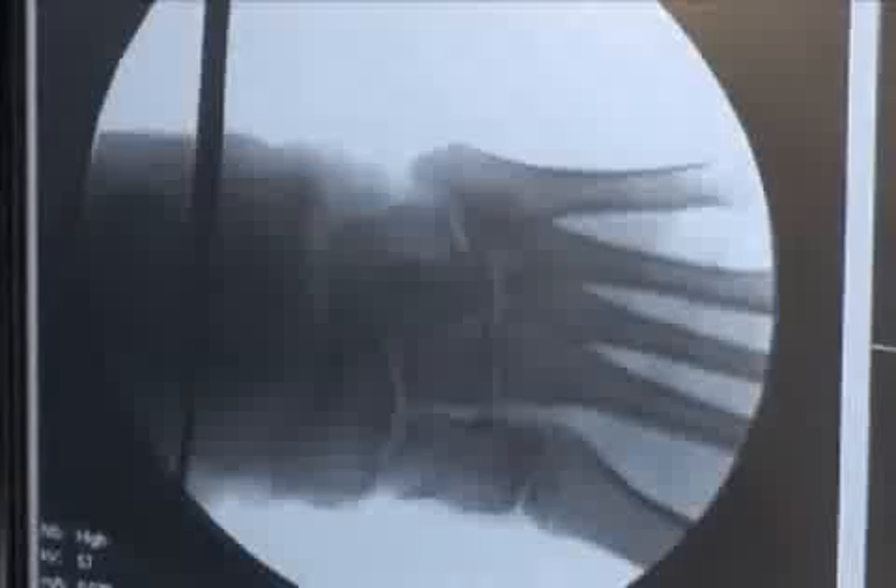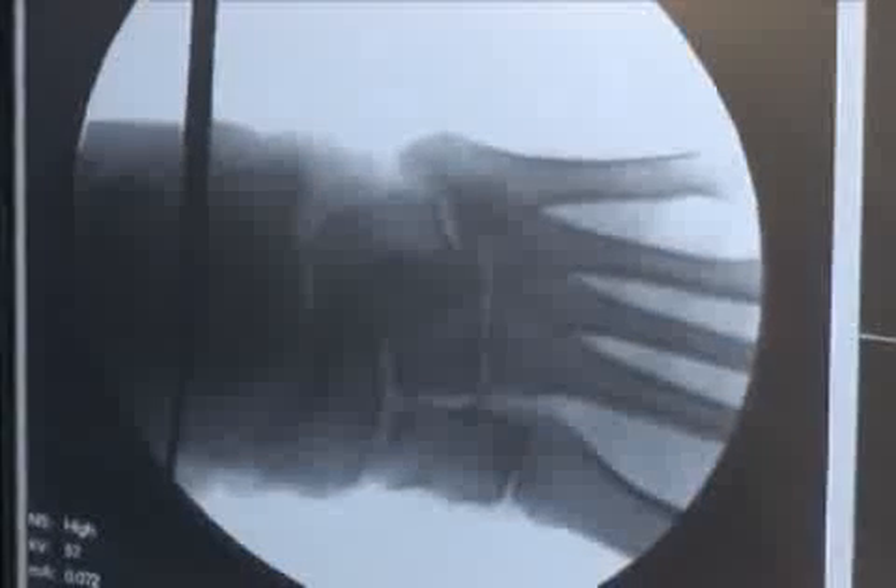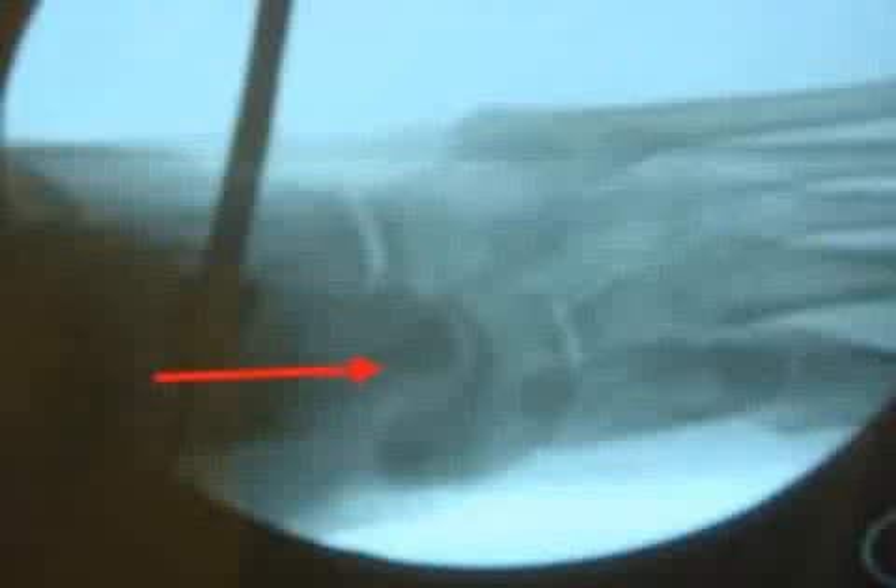Then you can image. When you take the intraoperative imaging, what you want to look for is the talar neck bisection. Get an appreciation for that because the leading edge of the implant or even the sizer should not go beyond this — namely, the medial portion of the implant should not go beyond the talar neck bisection.